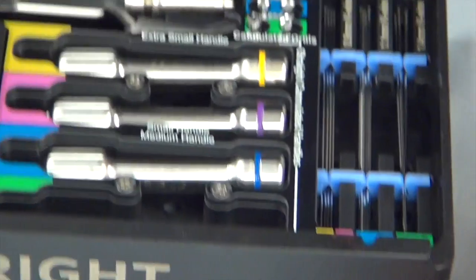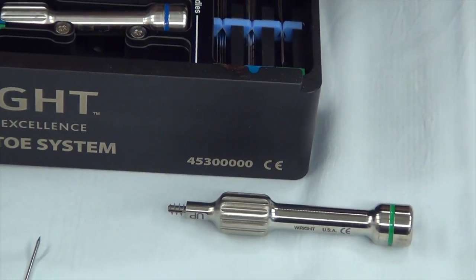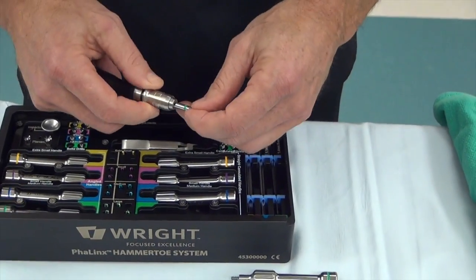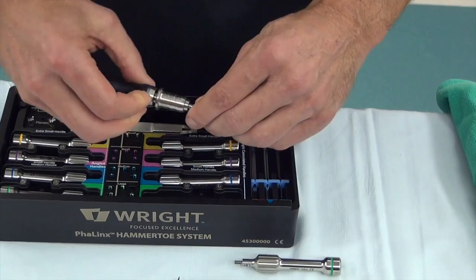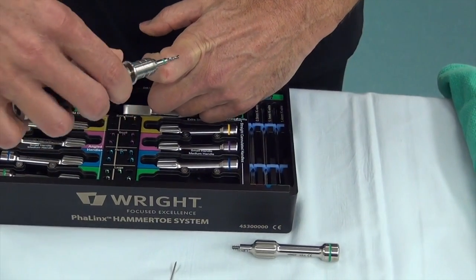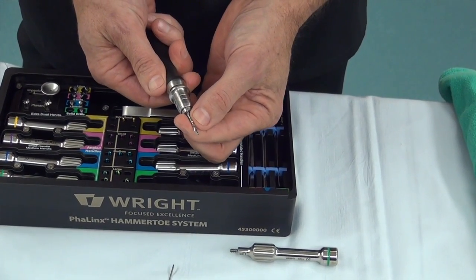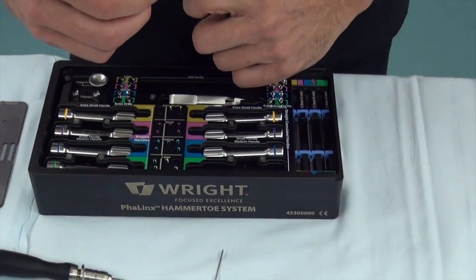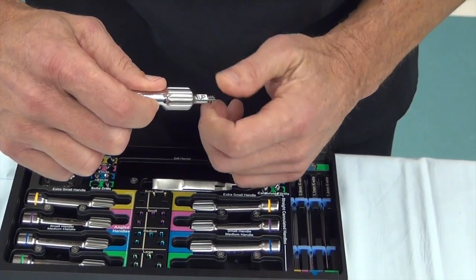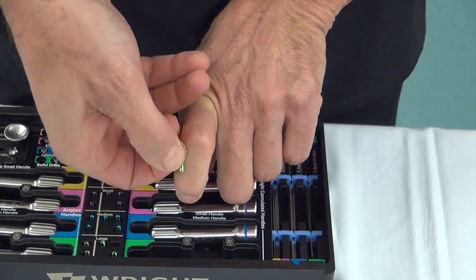So after you use the drill bits — color coordinated, we'll start with the green — you load it up on the handle. It's a stop and fastening device. You can basically pull the toe down, drill it down this bone, hand drill it down to this actual laser point here. And then when you're done, once the hole is made, you twist and thread this into the bone, then pull this out and pull the toe this way and reinsert it in this bone.